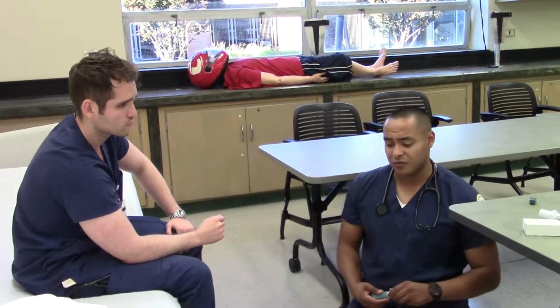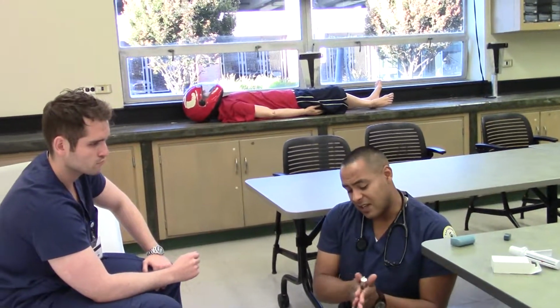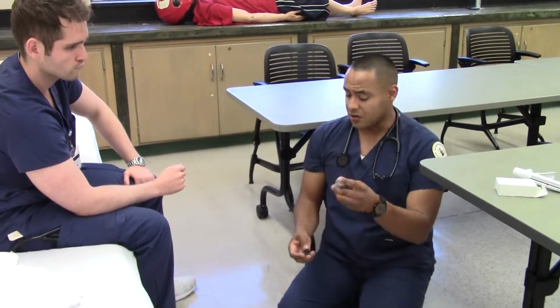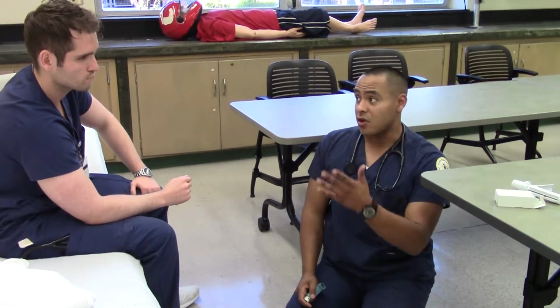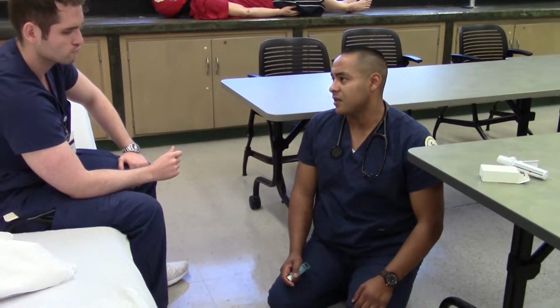Also, what's important too, before you use it, you want to make sure it's warm. There's medicine in here, you want to make sure it's mixed well. You got to mix stuff, shake it here. Get the medicine nice and mixed. And from there, you just put it down here. And then you breathe out, breathe in, hold for 10 seconds, and breathe out through your nose, okay? After you do that, you want to just wash your mouth out, because there's medication in your mouth, okay?